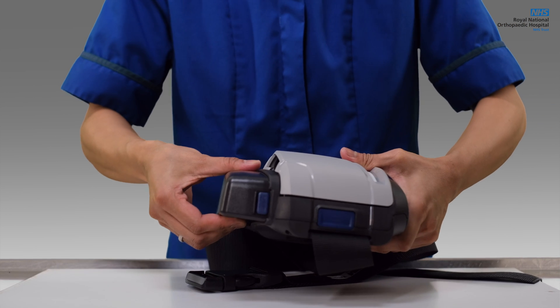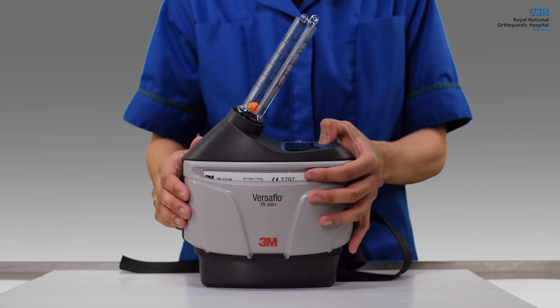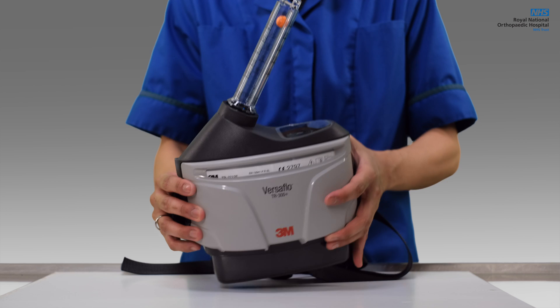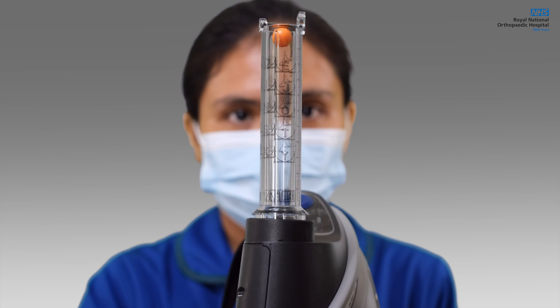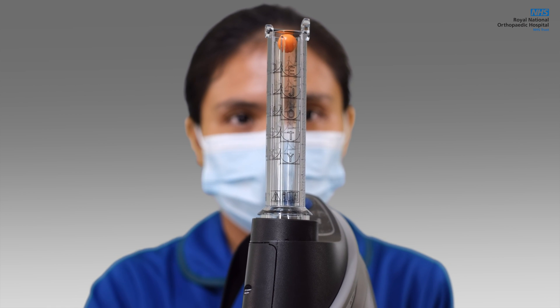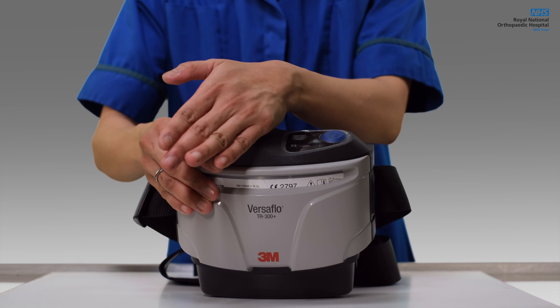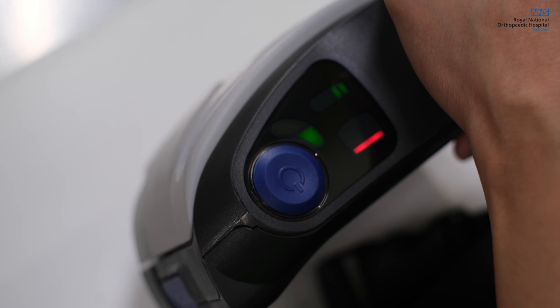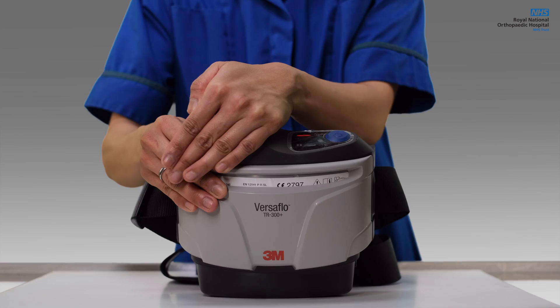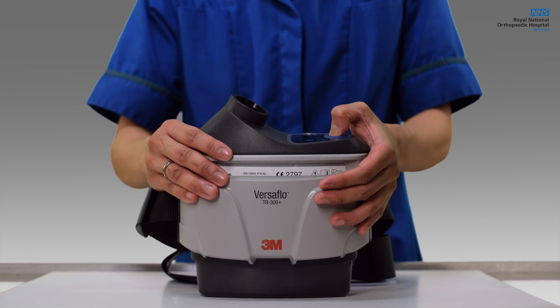Check that it's in place by gently pulling on it. Before using the product, check the airflow by using the airflow indicator. Hold the unit with the airflow indicator pointing upright. Check that the bottom of the floating ball rests on or above the minimum flow mark. Check that the alarms are working by placing a hand over the outlet of the unit. The alarms should sound and the fan LED should flash. During use, the alarms will indicate if it's clogged and or if the battery charge is low.